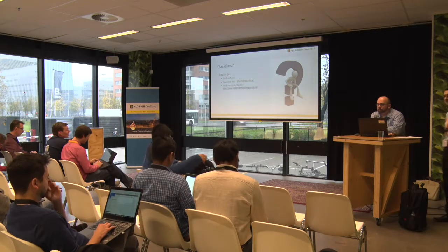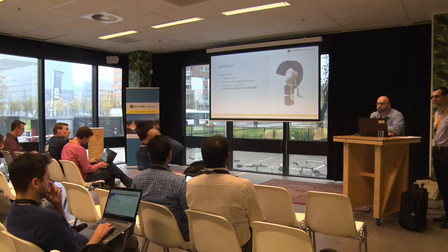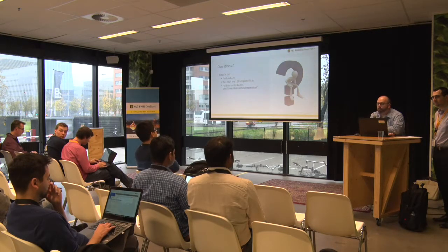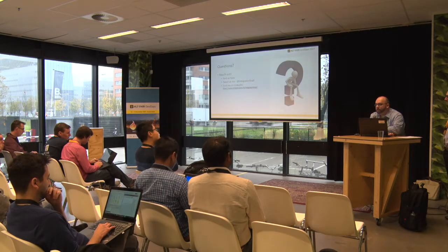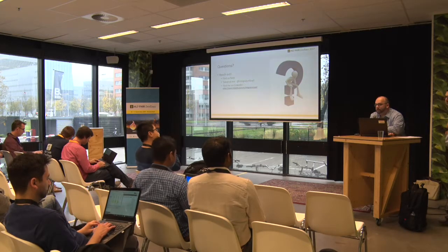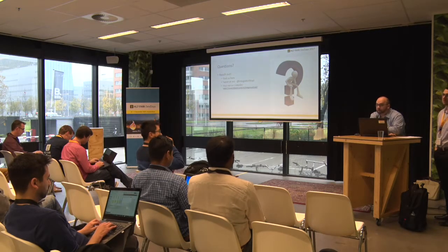With DICOM Web, we can use the Store RS you have shown us. So we can store the images in JPEG and PNG with the DICOM tags in the headers? Yes, absolutely. You can store the JPEG or PNG, and you upload a multipart related request, and the other object is an XML file which has what patient it belongs to and things like this, and then the server will combine that and store it as DICOM. Okay, that's expected on every system? Yep, absolutely.